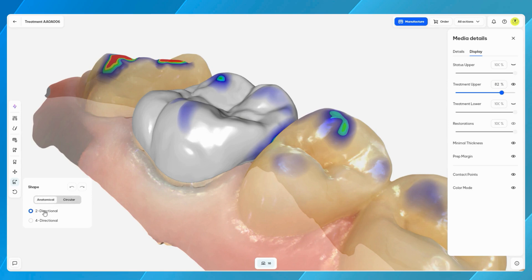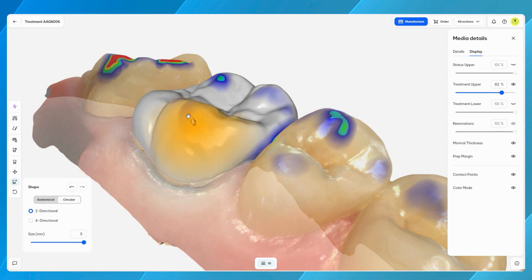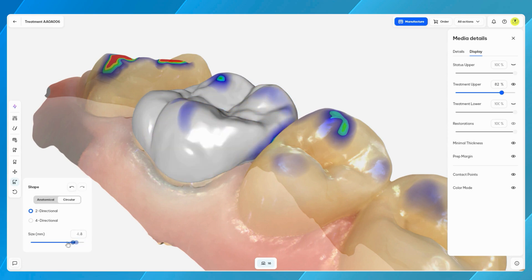The shape tool offers two shaping modes — anatomical and circular — to modify the restoration surface. Both modes support either two-directional or four-directional shaping, providing flexibility in how the material is manipulated. Anatomical mode adjusts the affected area based on the natural contours and anatomy of the restoration, ensuring changes blend seamlessly with the surrounding structure. Circular mode defines the affected area by a set diameter, allowing for more uniform modifications, and includes an option to define the diameter of the shaped area, enabling precise control over the applied changes.